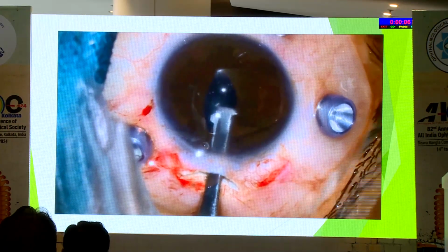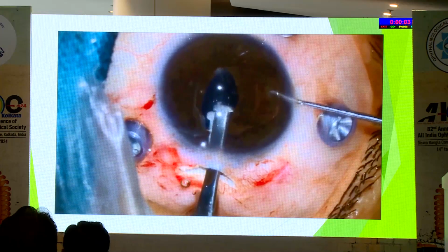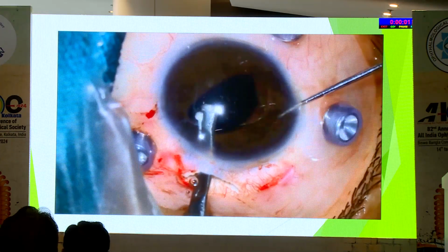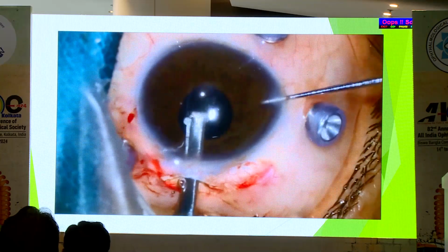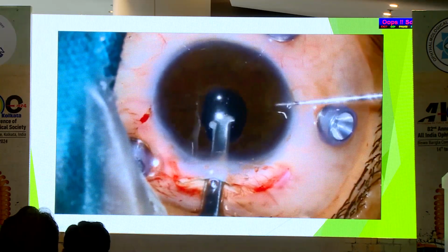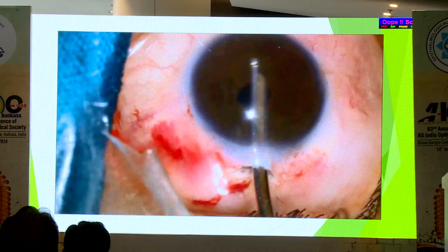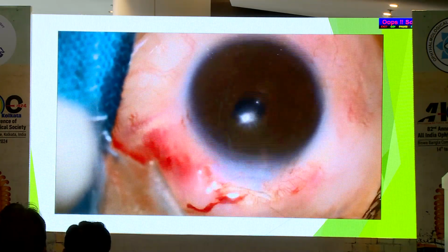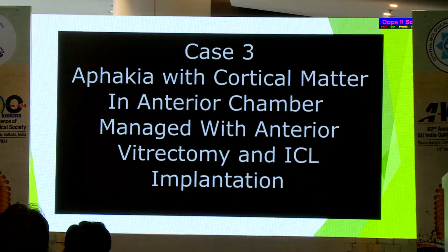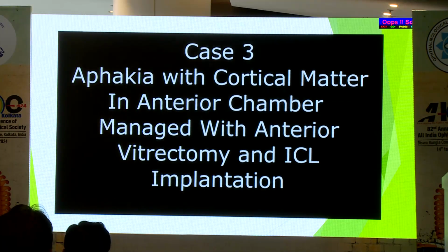And very easily you can enclavate. You will feel a jerk in your hand when it is enclavated. And if you don't see on the slit lamp, no one can tell whether it is a posterior chamber IOL or an iris claw lens.